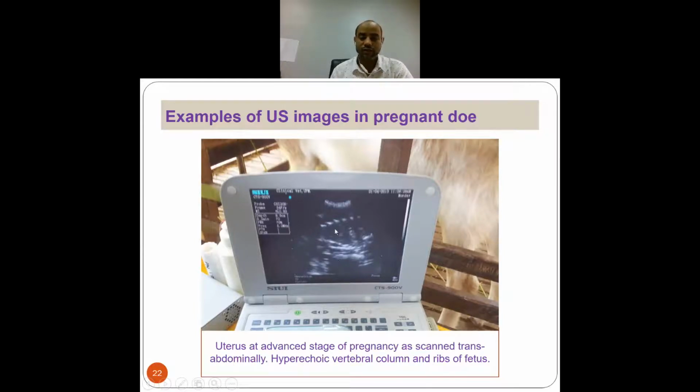And you can see here there are different mixed kinds of echogenicity on the screen. So you have a hyperechogenic whitish appearance, and you also have dark appearances around here. Those whitish, grayish white hyperechogenic spots along this way represent the vertebral column. And along this line, you can see a zebra cross of grayish white lines, right? And this represents the ribs of the rib cage or the thoracic cage.